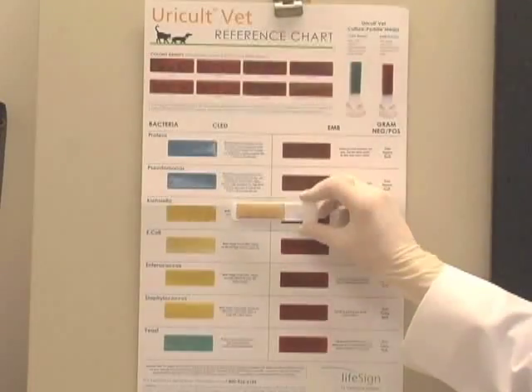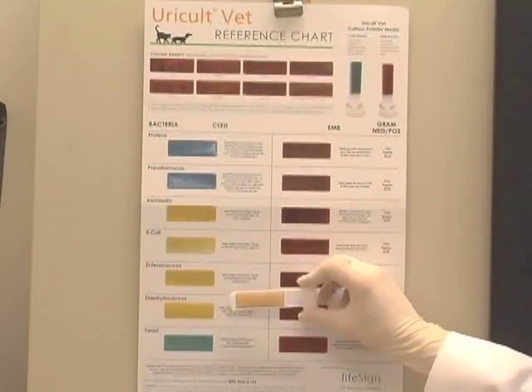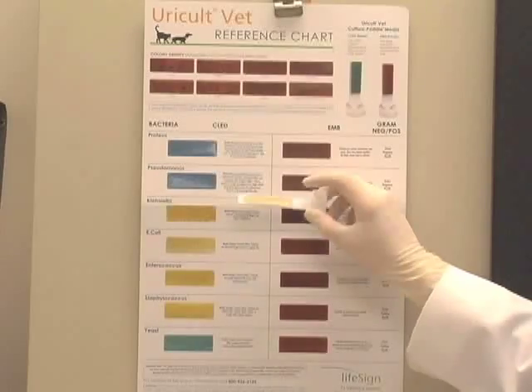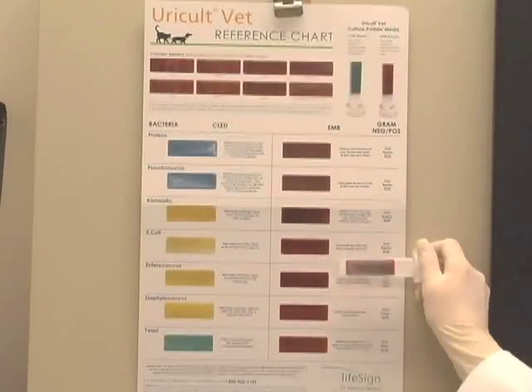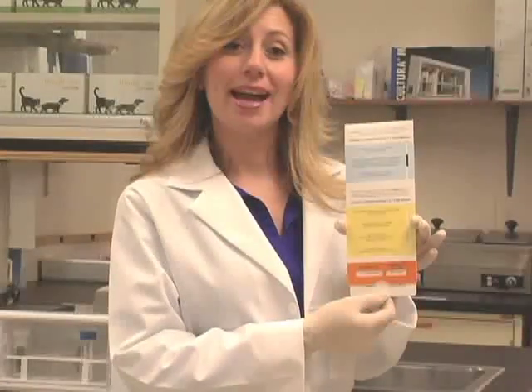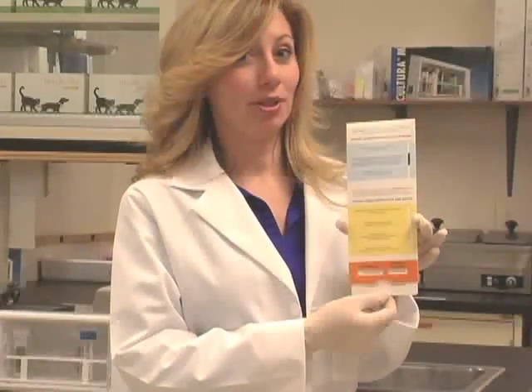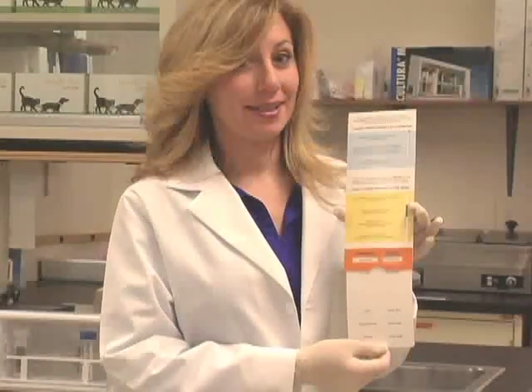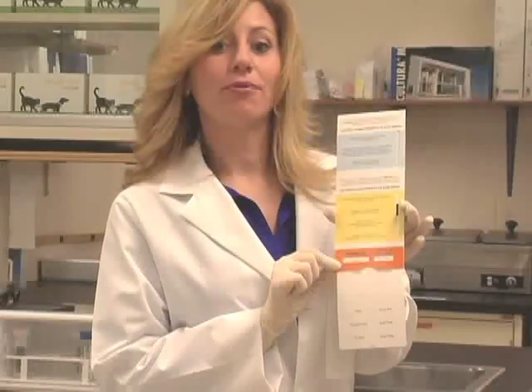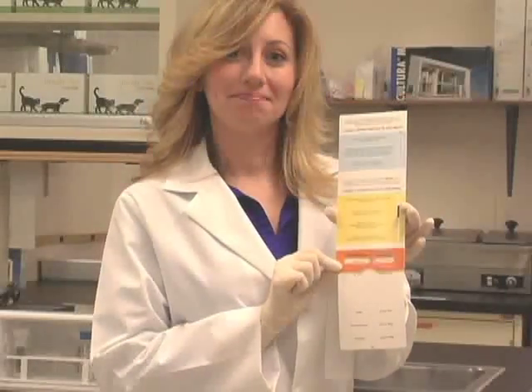Next, you should observe the previously green media for color changes. Compare the media color changes to the blue or yellow portion of the wall chart for interpretation. If you use the slide guide, set the black bar in the blue or yellow section that best describes the colony characteristics. View the orange area for your preliminary identification. Report your results. The Uricult VET paddle can now be discarded or, if necessary, it can be sent to a reference lab for confirmation and sensitivity studies.